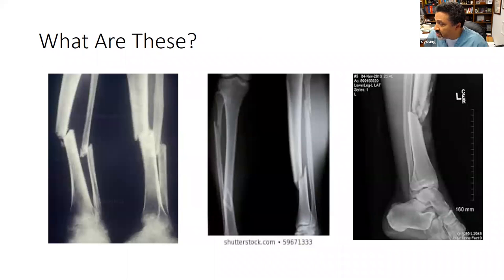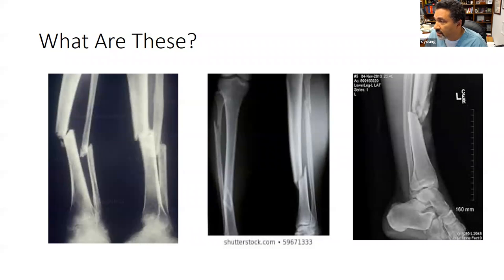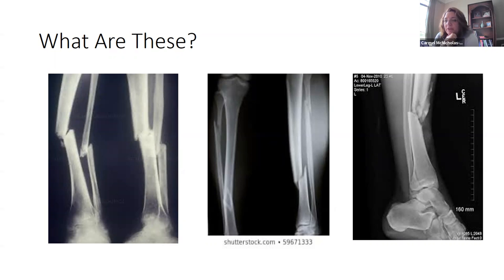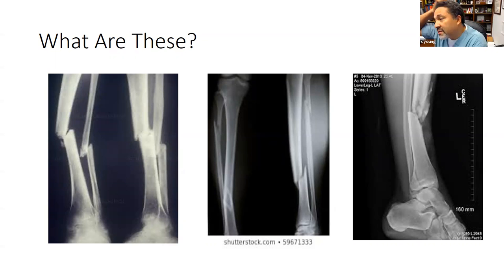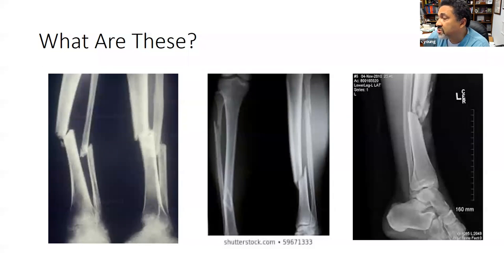The instructor puts up X-rays and asks students to think about what the injury is and how it happened, entering answers in the chat. Students identify tibia and fibula fractures. It takes a lot of force to break these bones — car accidents or falls with a tangential force are common causes. These are compound fractures of the tibia and fibula.